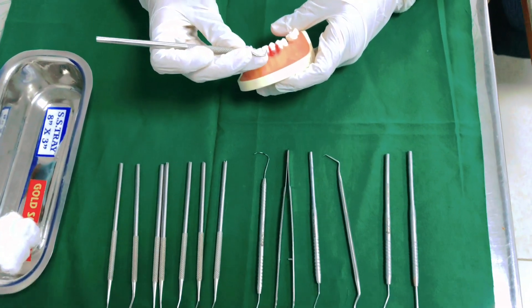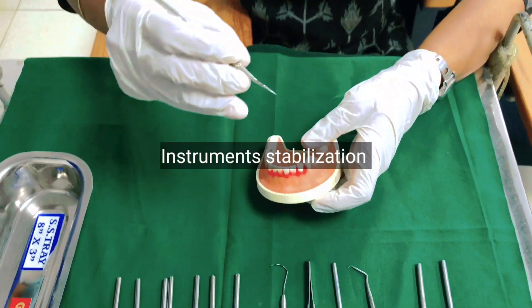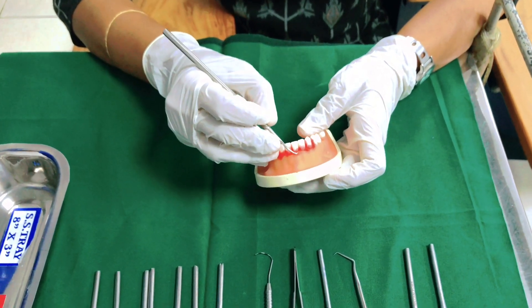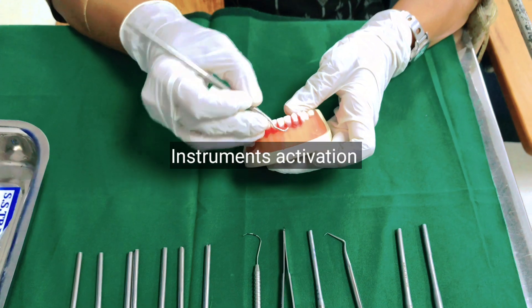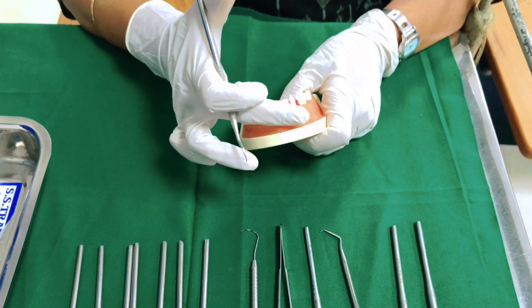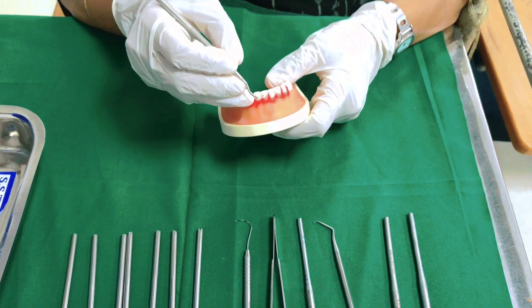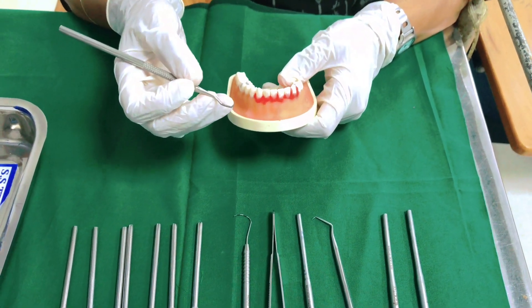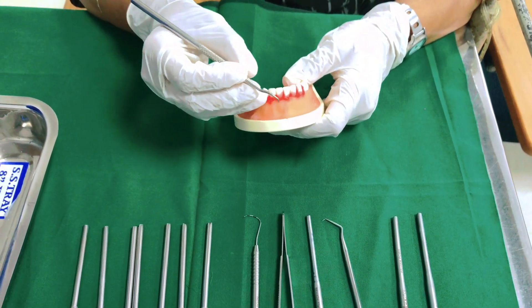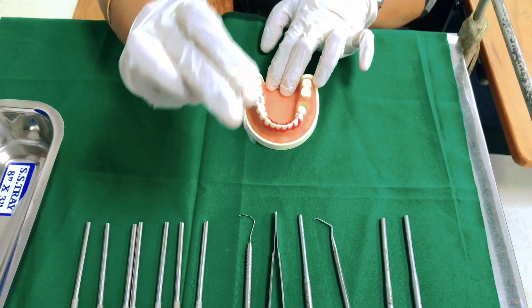Instrumentation involves instrument stabilization, which means holding the instrument in the right way — the modified pen grasp — and the hand rest. Next comes instrument activation, where you actually activate the instrument. In this model we have placed some amount of calculus, and I'm going to show you how we are going to remove it. The two main aspects are instrument stabilization and instrument activation.